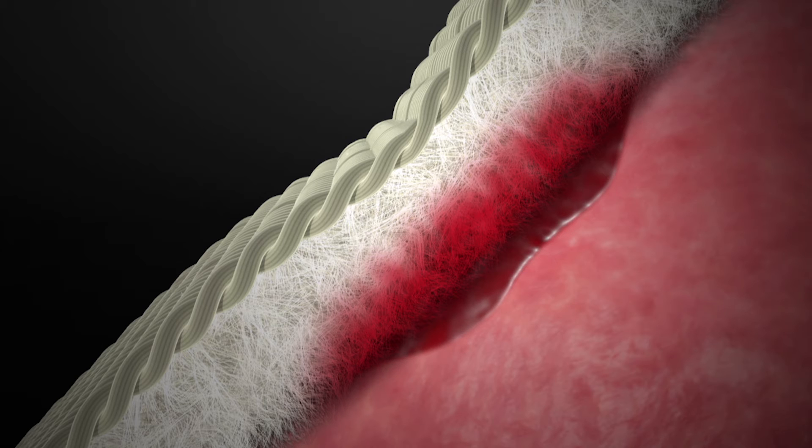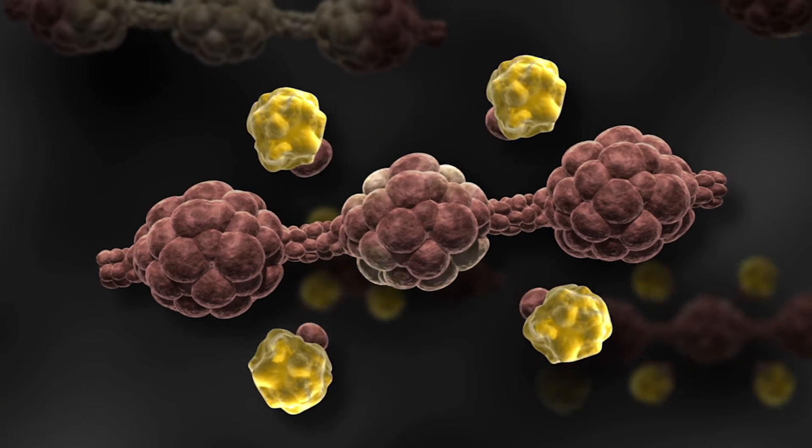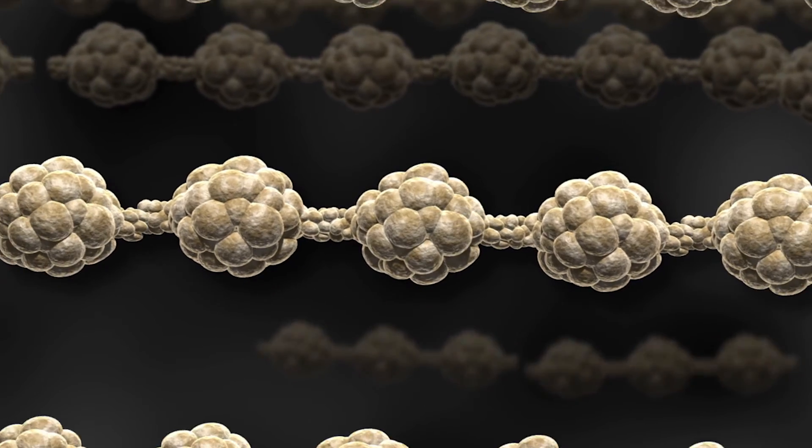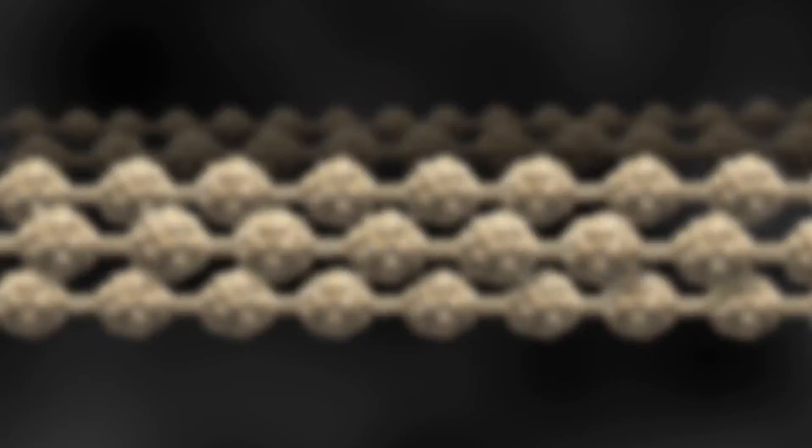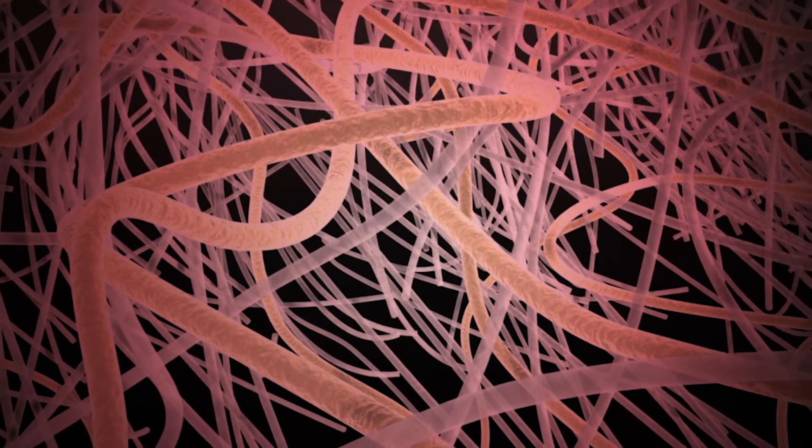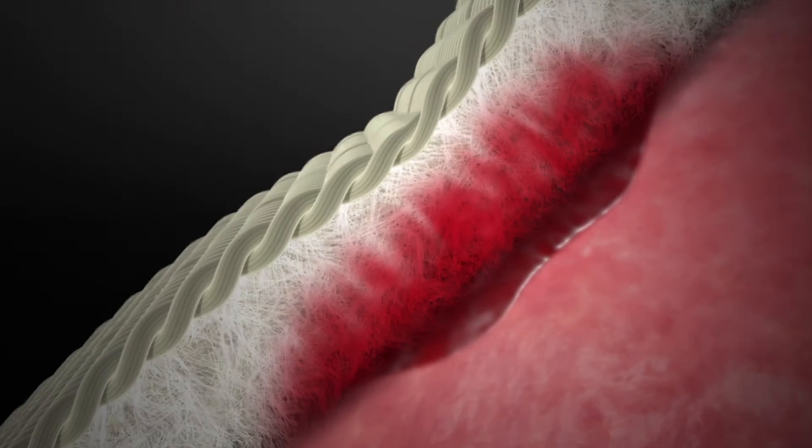Upon contact with blood, the clot formation process begins. Once hydrated, the thrombin cleaves fibrinogen, initiating the conversion of fibrinogen into fibrin monomers. These monomers then polymerize, leading to the formation of fibrin strands. This activation results in clot formation at the bleeding surface within the patch.